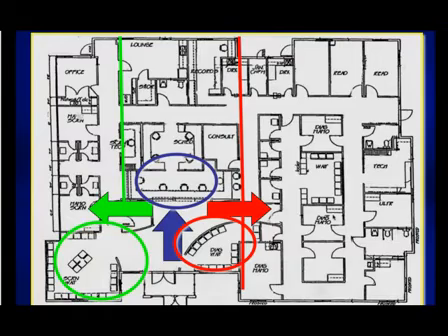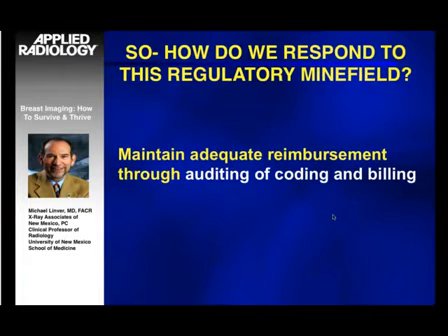And this is the diagnostic section where we have the diagnostic mammogram machines and the ultrasound. And again, they have their own waiting area, so we totally separate screening and diagnosis. It has made us so much more efficient. I can't even begin to tell you. If you can do that, I would urge you to do so. So what else can we do?